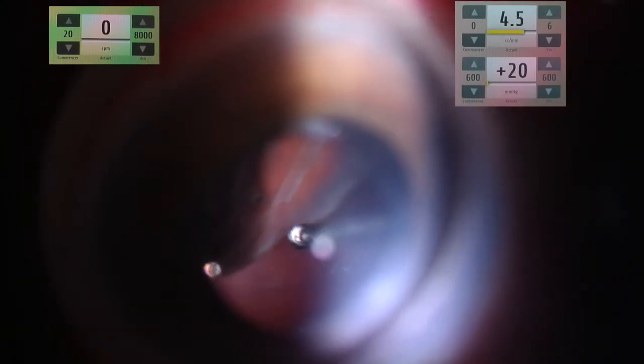This is dangerous because high-speed cutting can bring the retina to the port in a tenth of a second. Here is an example where, although cutting at 4,000 cuts per minute with a flow rate of 3 cc's per minute and a vacuum around 10 millimeters of mercury, therefore extremely safe parameters that normally do not allow the retina to move, the TDC system caused me to get a retinal bite.